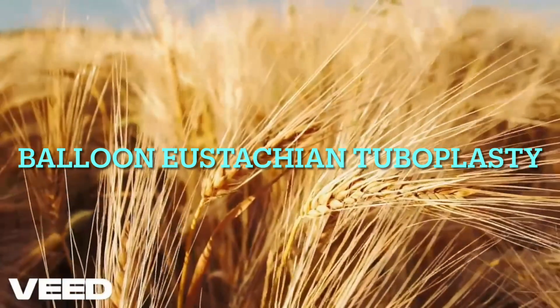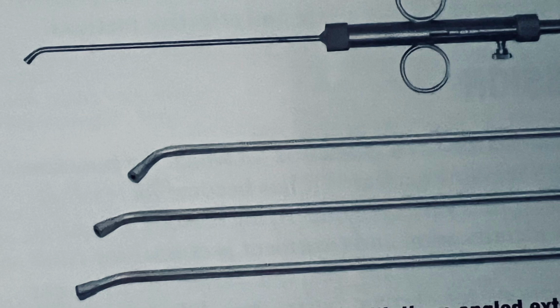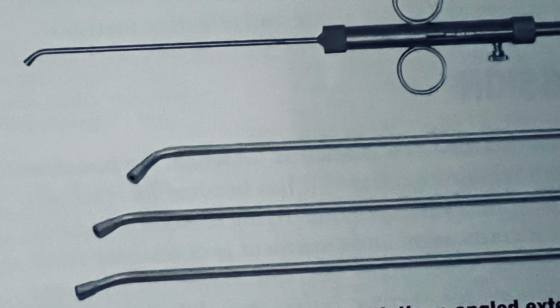Eustachian Tube Dysfunction, or ETD, affects millions worldwide, causing symptoms like ear fullness, hearing loss, tinnitus, and barotrauma. Balloon dilation of the Eustachian tube, BDET, is a minimally invasive solution for chronic ETD. In this video, we'll explore the anatomy, indications, procedure, and outcomes of BDET.